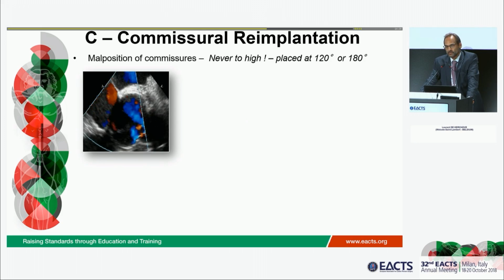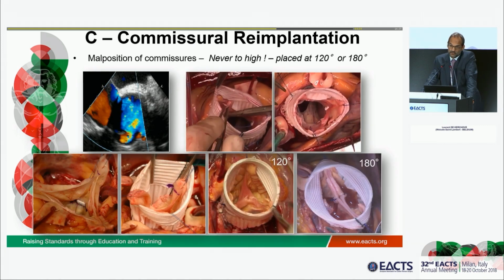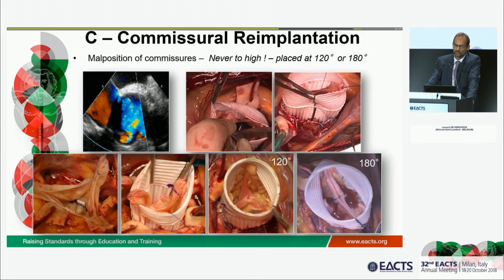Now, positioning of the commissure is probably the most important step in the valve sparing reimplantation. A commissure reimplantation is never too high. It can be too low with residual prolapse, and this is the case on this echographic image. Generally, we pull as maximum as we can on the commissure without pulling on the graft, and in the remodeling procedure, they do very similarly.